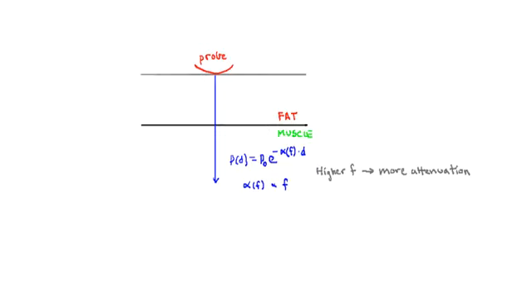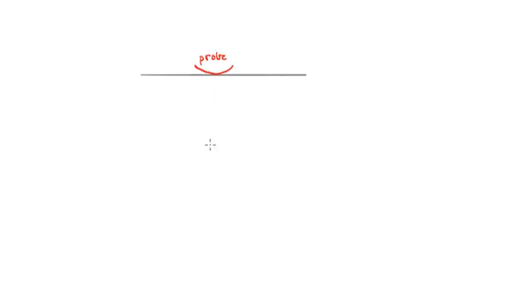All right, so I still have not told you how we make an ultrasound image, but we have all the concepts. Let me see if I can walk through this. So let's say you want to image 2 objects here underneath the probe at different depths. What that would involve is resolving the fact that the reflections off the 2 of these come back at different times to the probe. If you can do that, then you can image it.